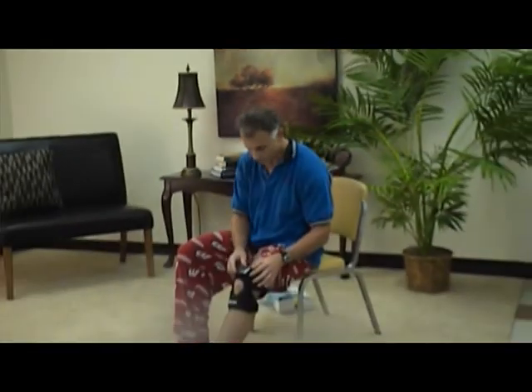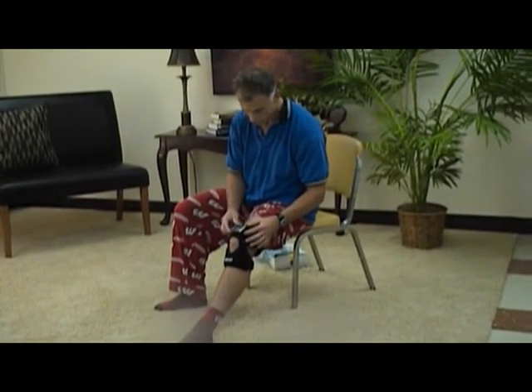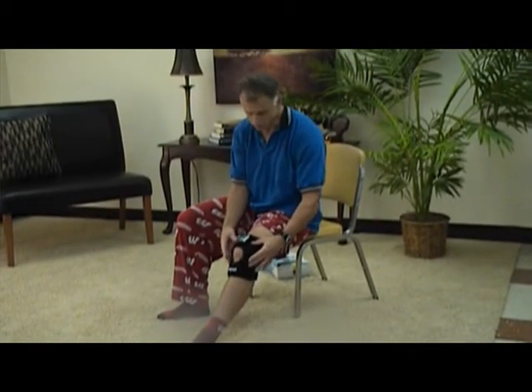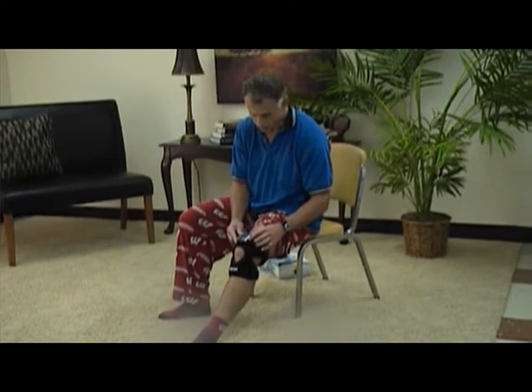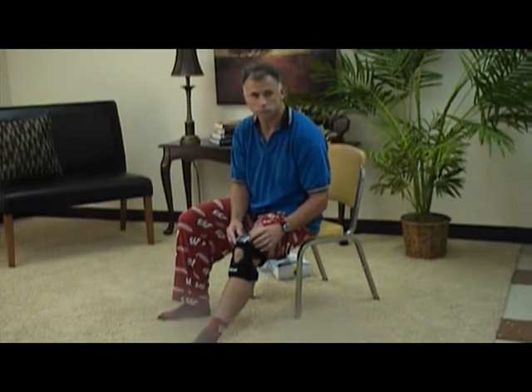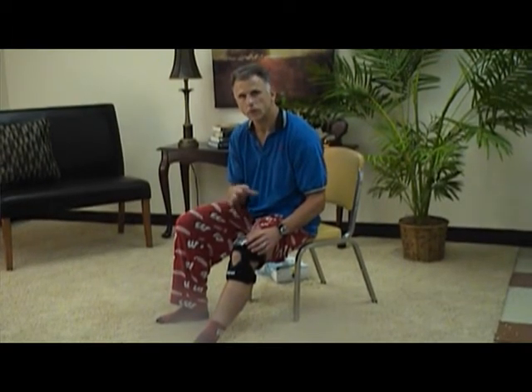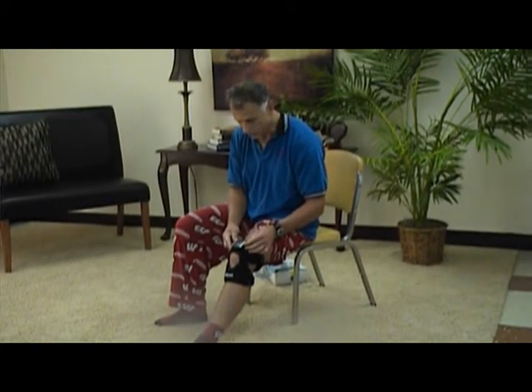Let's put it on. All right, so I'm going to turn it on, and I can feel it. It feels like pins and needles on my knee right where the electrodes are. On the side, I'm going to simply increase the intensity, and I can start to feel it now. You'll definitely feel it. You want to bring it up to an intensity so it covers up the pain. It doesn't give a consistent pulse, it fluctuates up and down. So if you feel that, it's not that it's broken, it's meant to do just that type of stimulation. It's variable stimulation.